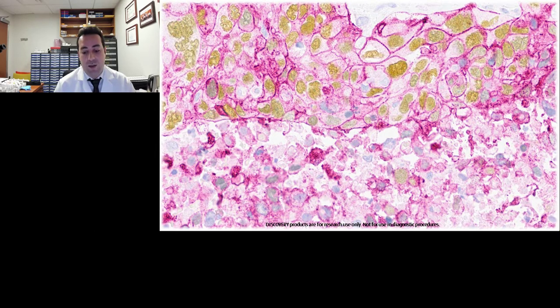Actually, it is hard to discriminate on monostain whether the PD-L1 positive cell is really a tumor cell or a macrophage, especially in tumors with solid pattern like this and abundant macrophages around. They can be positive for PD-L1 and easily be misinterpreted as a tumor cell. So marking tumor cells with TTF1 at the same time facilitates the interpretation and therefore provides a better PD-L1 scoring.